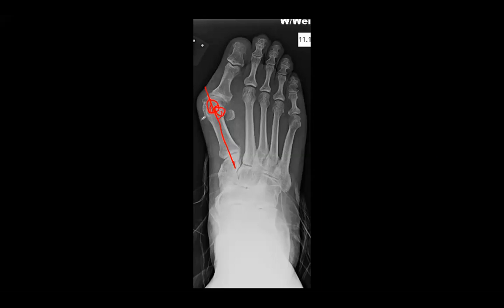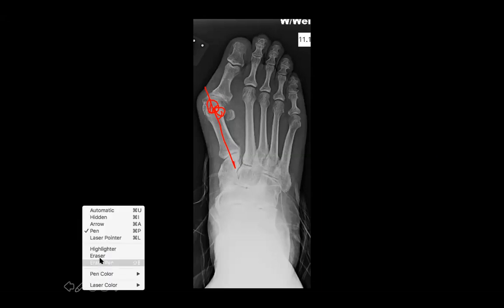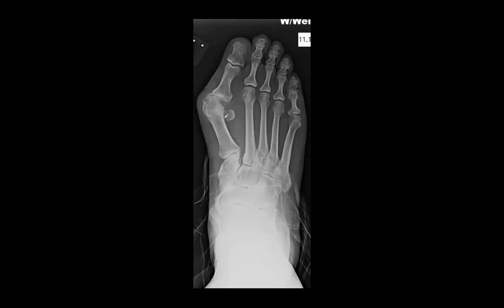Just like if you go the opposite way, 3 should have some overlap, 2 kind of touching, 1 would be some gap. So just remember 4 is right down the middle of it. And then next, we can get into the first and second IM angle. Right. What is that normal? 0 to 8. Okay.